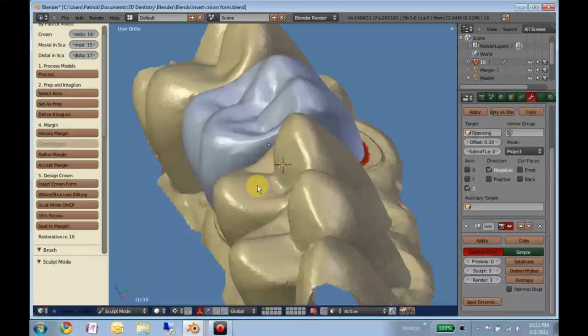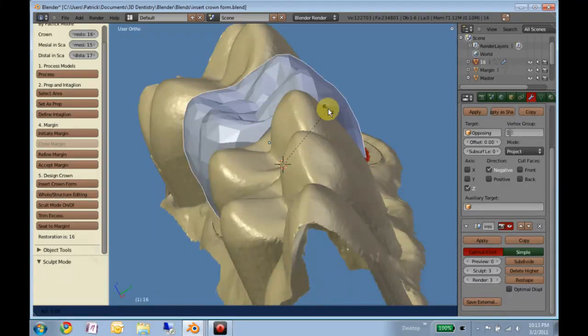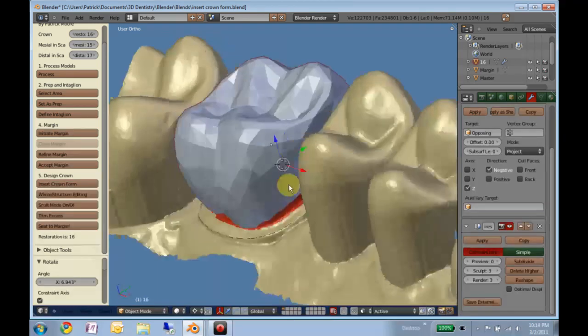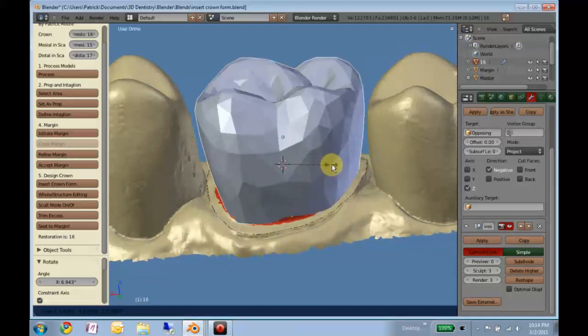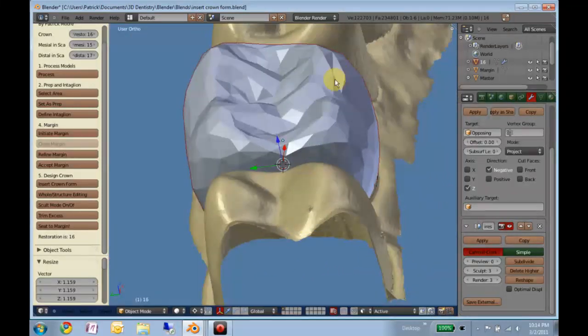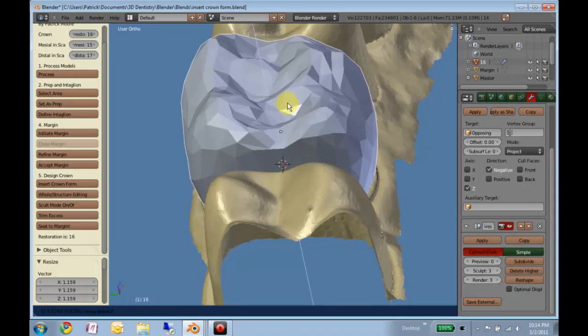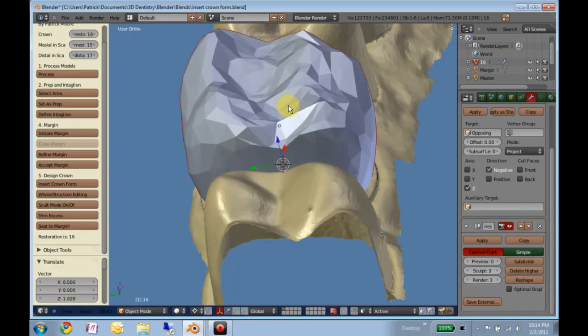Actually, let's get this a little more. I won't bore you with the details, but we'll just get this roughly in place. You can hit S to scale, get bigger. That's fine. Alright, so you may notice something funny going on here. If I grab this in Z and move it up, notice it's getting all pushed and deformed.